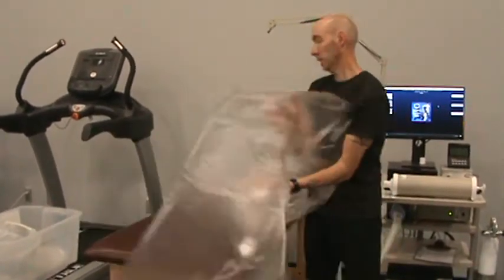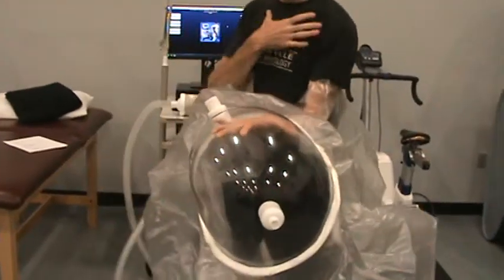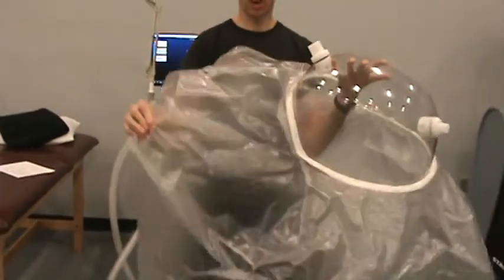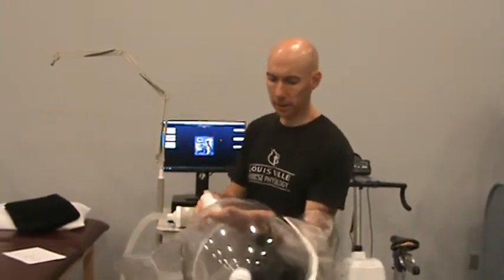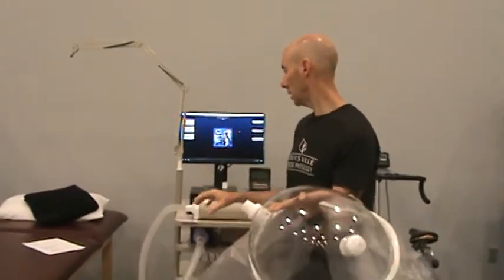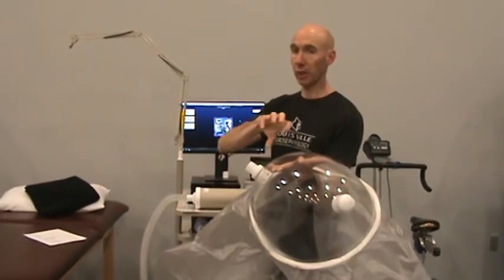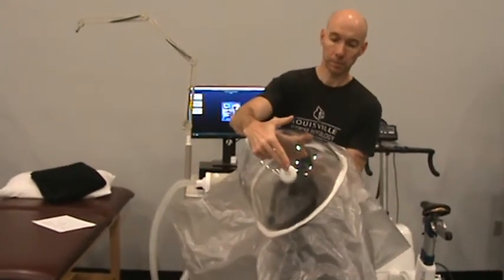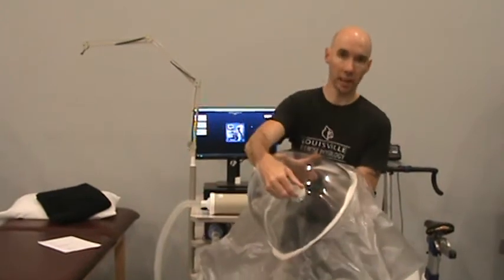So what we'll do is place the bubble, which is hard plastic, over top of our subject's head and upper thoracic cavity. We're going to then wrap the soft plastic drape around the back of the pillow, around the torso, and flatten it on the stomach. Okay. We'll then hook up the hose to one end of the hood. That's for expired gases. Inspired gases are going to come in through one hole that we'll leave open. Okay. It's critical to make sure this is not covered.